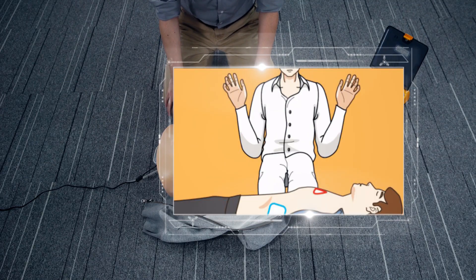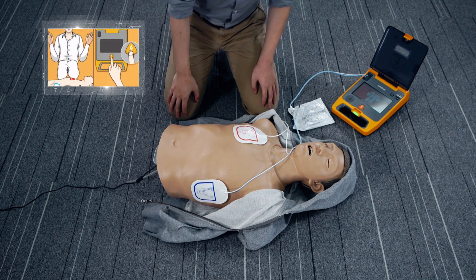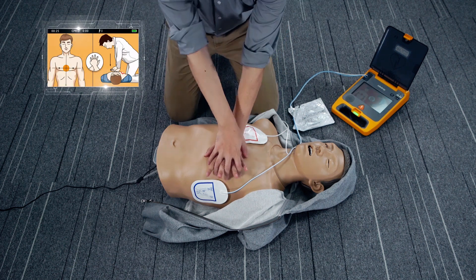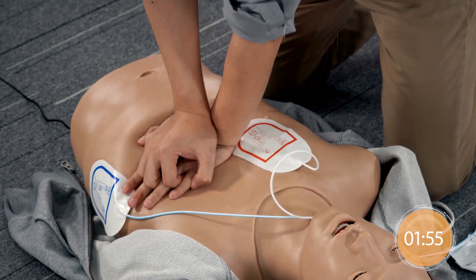Do not touch the patient. Analyzing heart rhythm. Shock advised. Shock delivered. Start CPR immediately. Follow the metronome to give 200 compressions approximately.